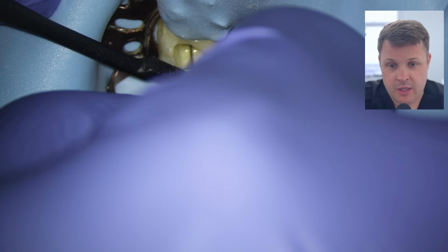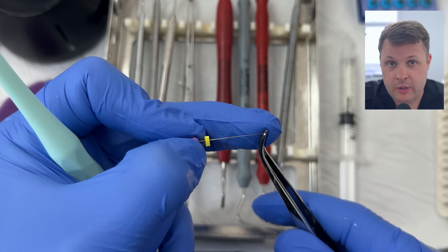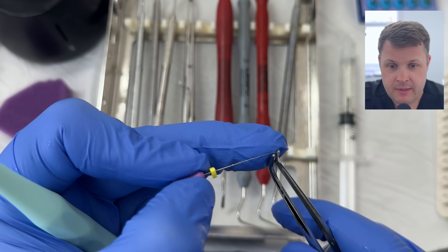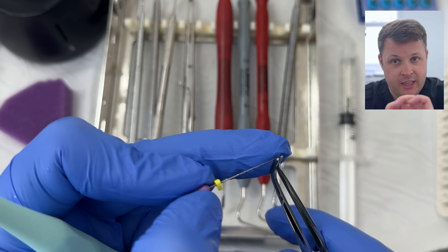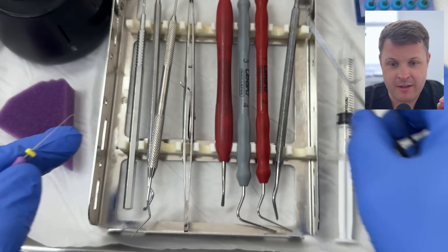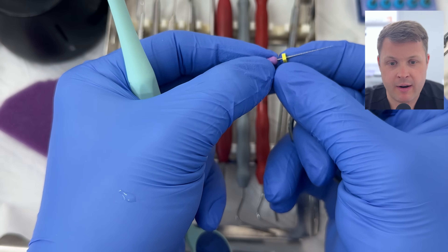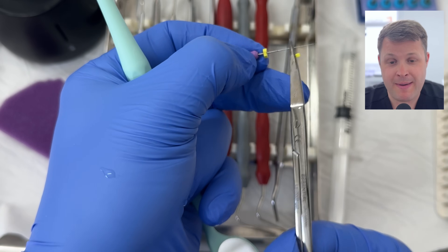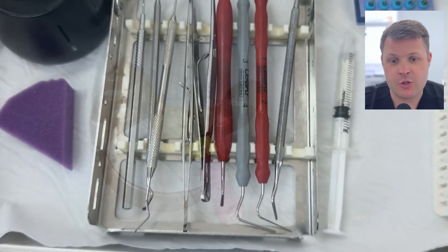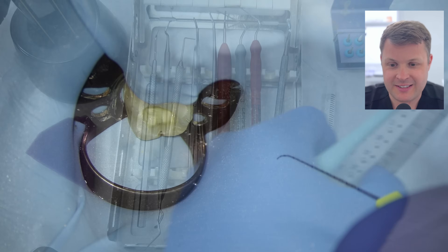As I negotiate down this distal root of the lower six, I feel like I'm not reaching the apex at all. When we're not reaching zero, the next step is to make a very small bend at the end of the D-finder. The worst thing to do is make a large acute bend, because once you place it into the canal it loses its shape. A very very small tip bend will keep its form and allow you to negotiate around. The stoppers on these files are symmetrical, so you don't know where the bend is — I like to chop off one apex of the rubber stopper so I know the orientation.